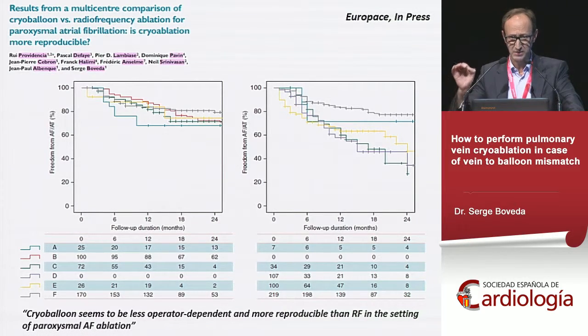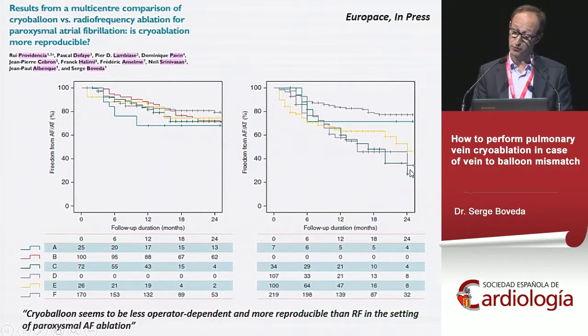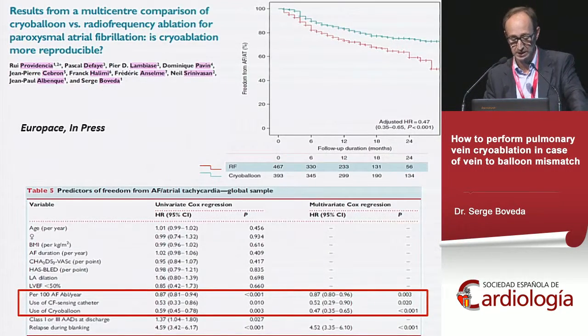And I believe that this is real life, and it's really important to share that the results for cryo are the same. And for radiofrequency in the big volume center, it's exactly the same results as with the cryo. No doubt, it's the same. But for the lower volume centers, you can see that the standard deviation is large. It's going from 40% of success at one year to 80%, which is very different for this technique.